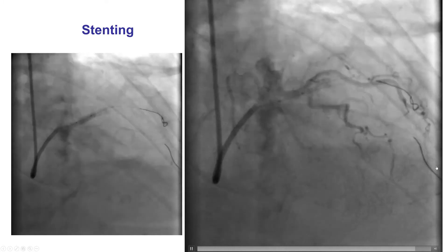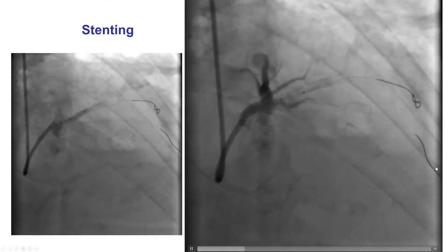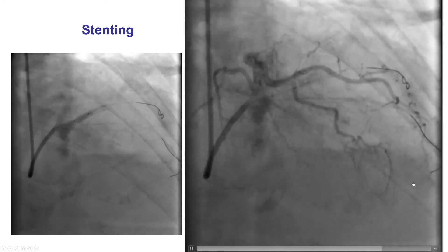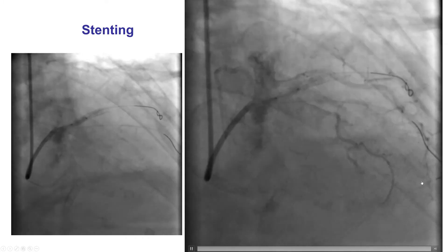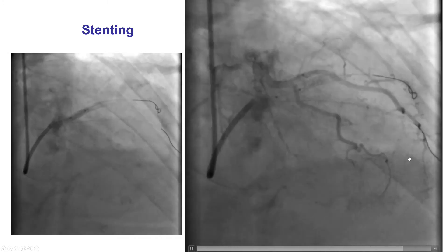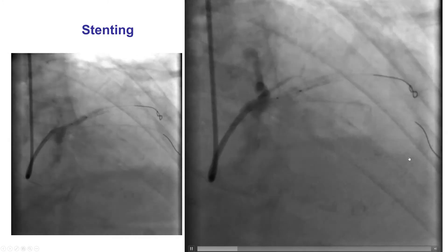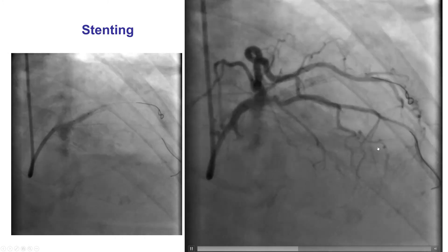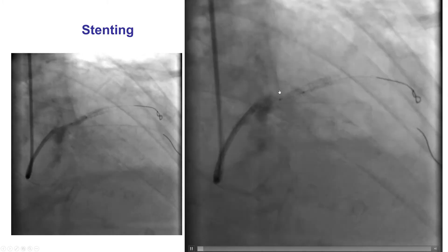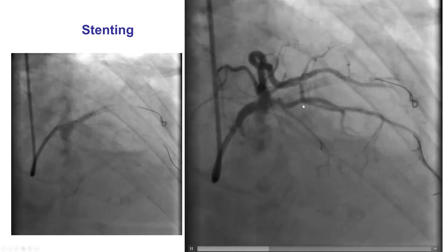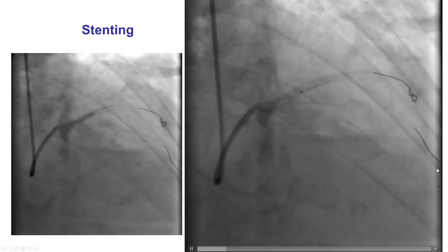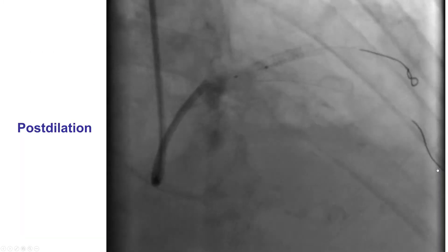Even though it's a workhorse wire, it went into the septal and seems to be causing some sort of a problem. At the time, this was not recognized, and it is not uncommon to focus on the area we're working on — the lesion — and forget to pay attention more distally. That is the key message from this case.